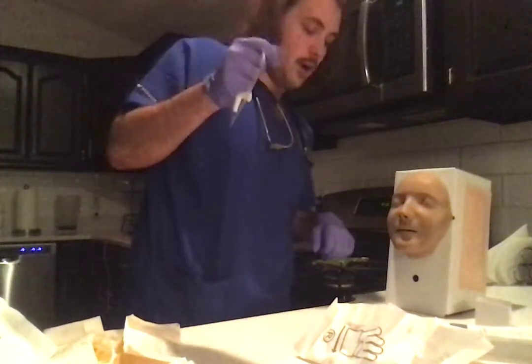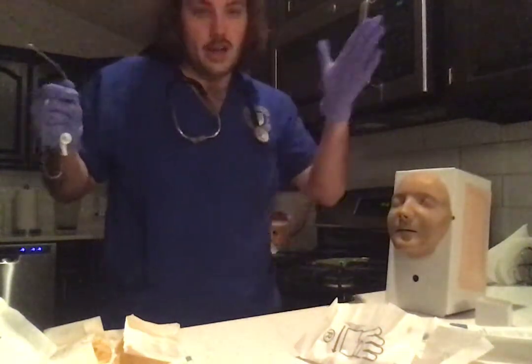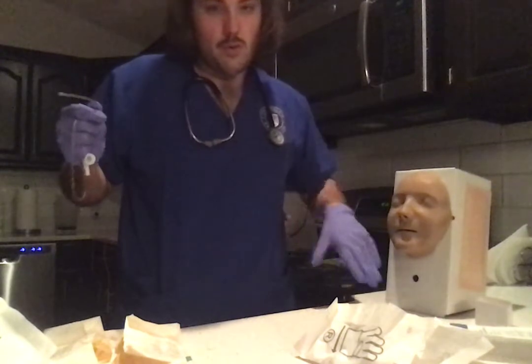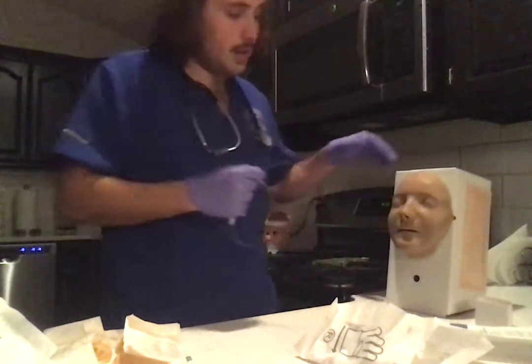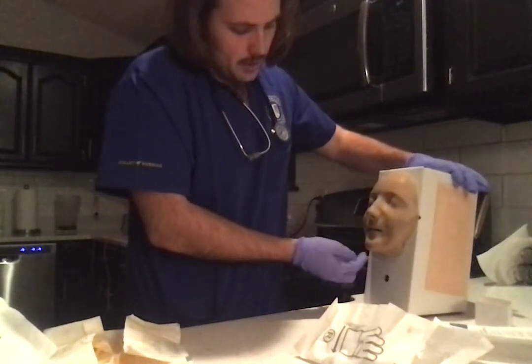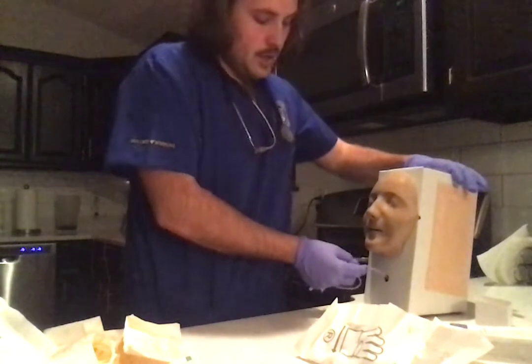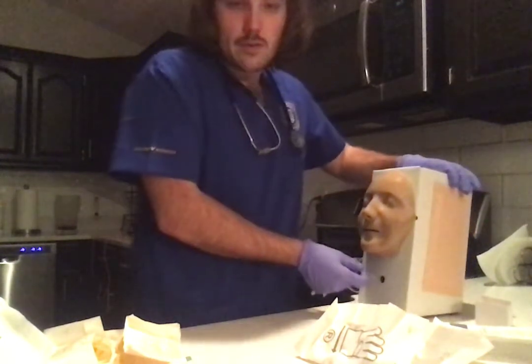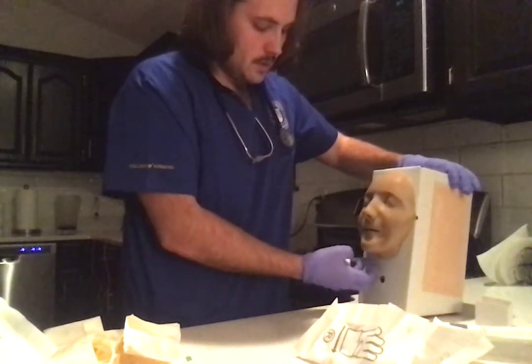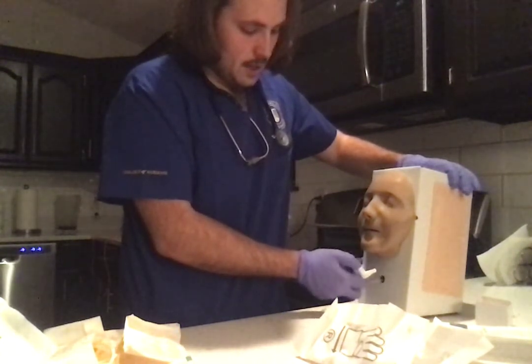We would then dip the end of our catheter in the saline solution to help lubricate it. Use our non-dominant hand to remove the trach mask itself, and with our dominant hand, we're going to slowly insert this, not too rapidly. You want to insert until resistance is met or a cough, and once you've met resistance, plug our suction and then begin pulling out.